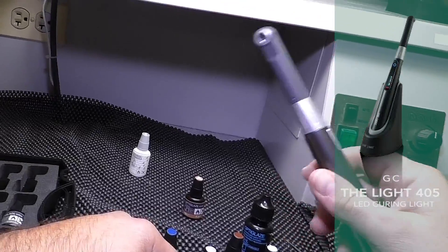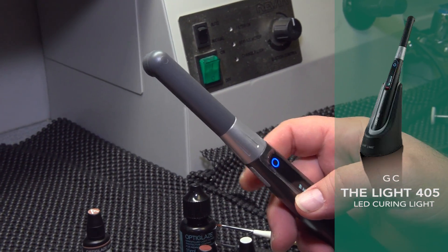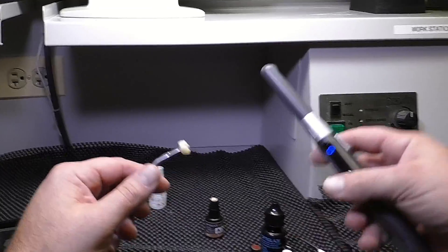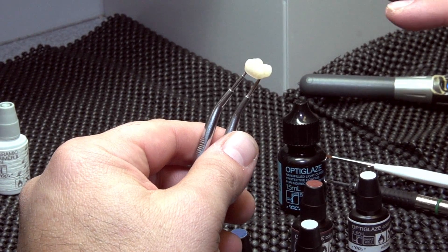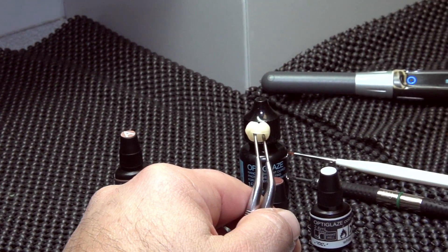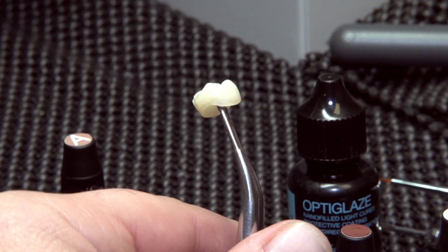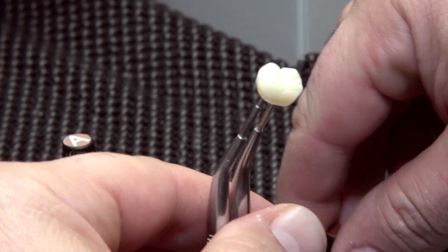We then take the light 405, which is the ideal wavelength to cure OptiGlaze color. Go over the entire surface where we added shade A. For the final cure we'll do 40 seconds, but first we're layering our shade foundation and light curing each increment as we layer each shade. Some may feel this is enough at this point, but we're going to go further and show some stain within the pits and fissures to get that illusion of depth.